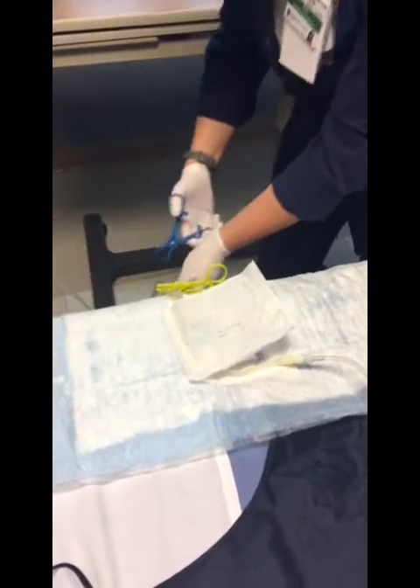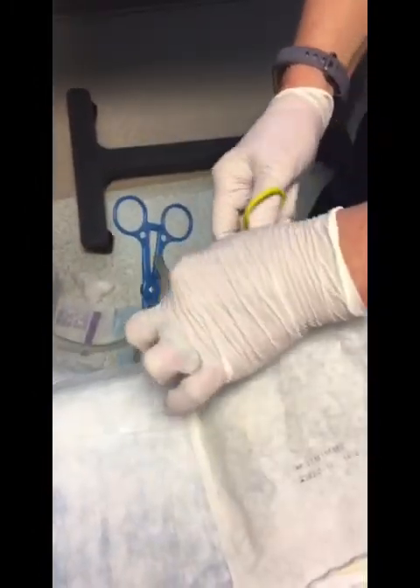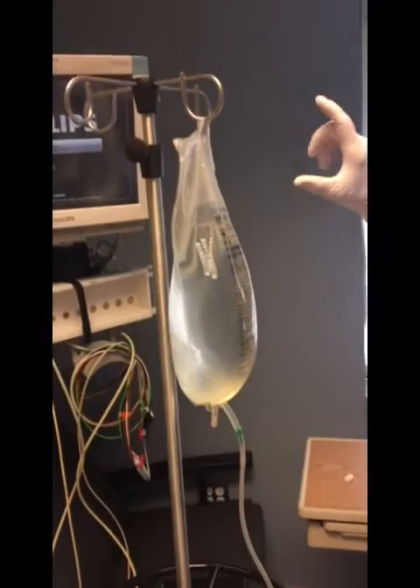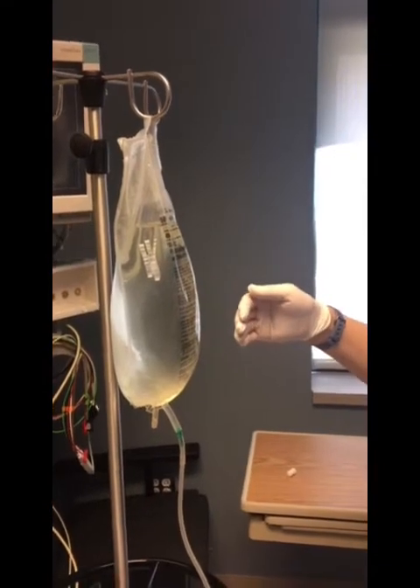Once all of that is done, take your clamp back, clamp the lower, and now you're going to fill. Take the clamp off and fill. The doctors will let you know — these bags are 2,500 cc's, but they may say 1,000 or 1,500. In that case it comes with a scale; you use that to figure out how much goes in. This will take roughly 10 minutes to fill. Once everything is in, clamp it off.